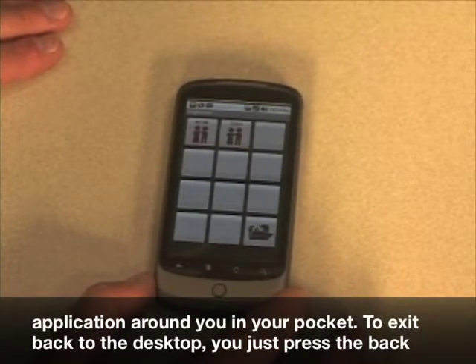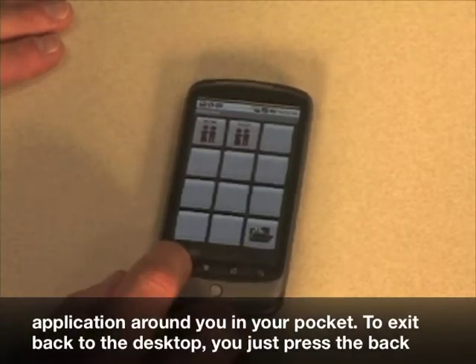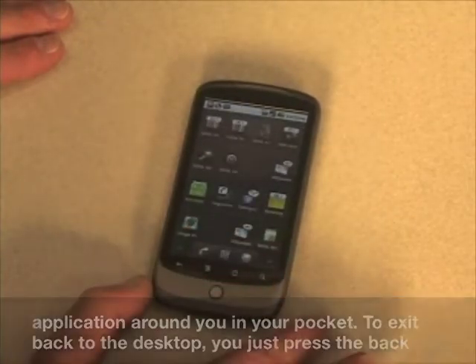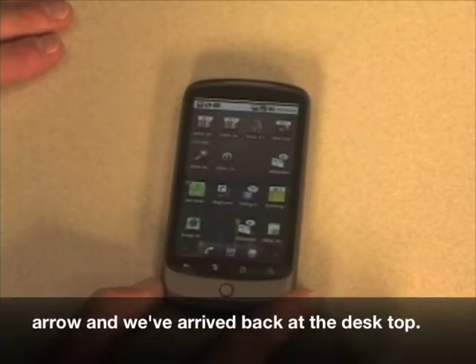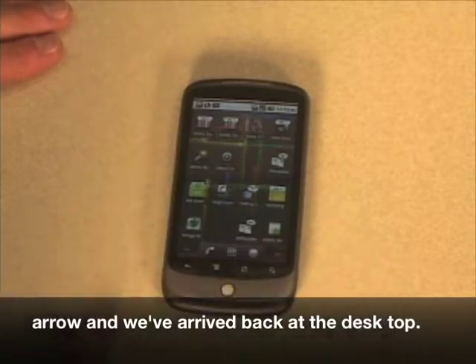To exit back to the desktop, you just press the back arrow and we have arrived back at the desktop. For more information, please visit MyWirelessReview.com.